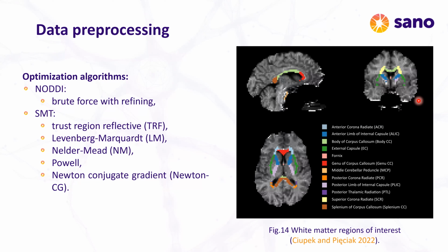A publicly available white matter atlas based on DTI was used to define the brain regions in which the analysis of microstructural parameters was performed. The microstructural parameters estimated for one subject were registered in the common space of the given atlas, and then 12 regions of interest were selected from them.